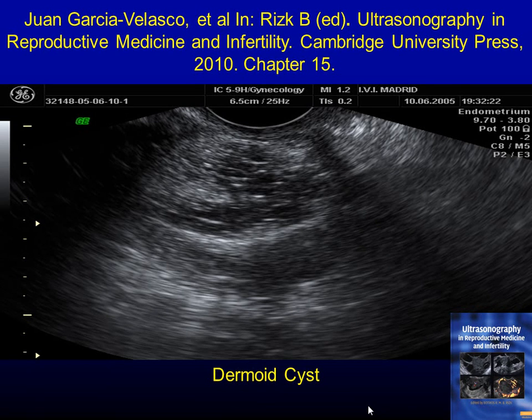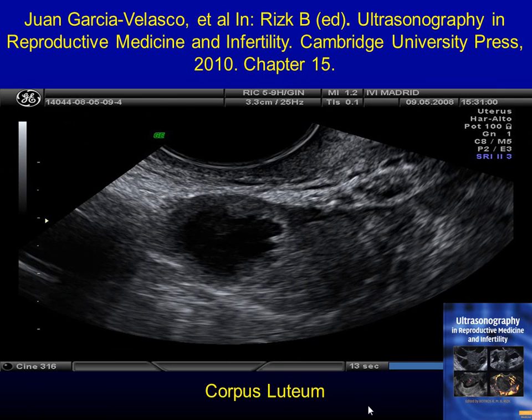Those patients, we always use a bag with them, so you take the dermoid, you put it in a bag and bring it out with the bag. If you don't, it will mess up the area in between, and potentially could cause a different kind of subfertility problem. But again, you have to train your eye that this is what a dermoid looks like.